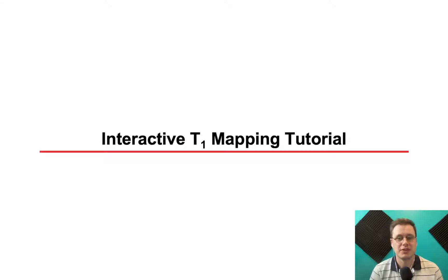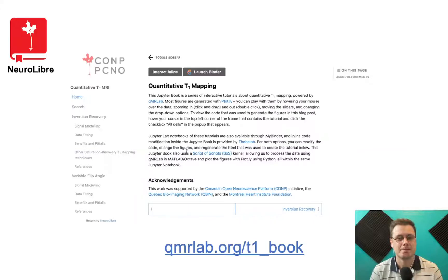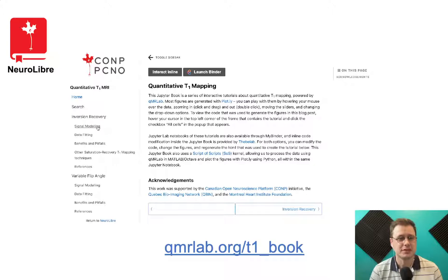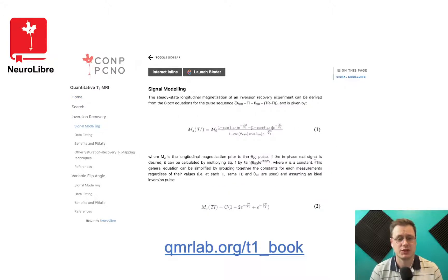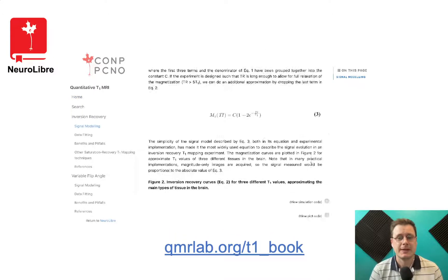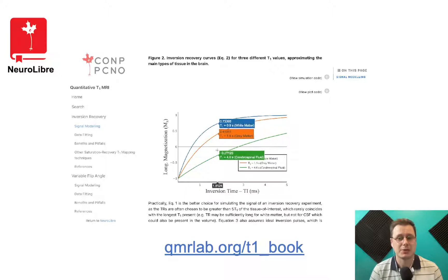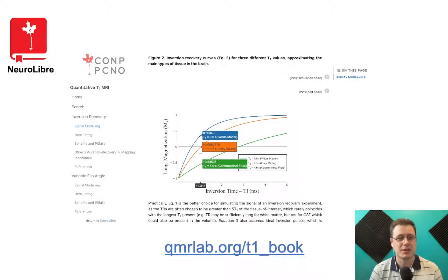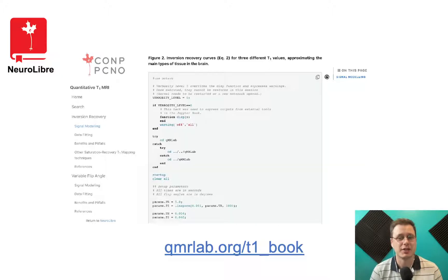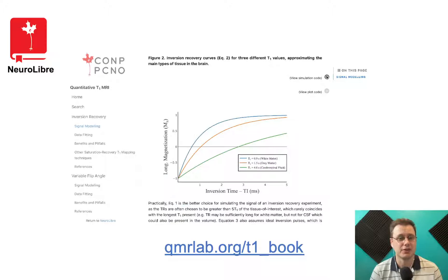Next, I'd like to briefly mention some interactive tutorials we've developed that focused on T1 mapping. Here's a short demo of one of these web tutorials. You can see there's a lot of explanations and equations. The figures are powered by Plotly, which makes them interactive. You can also view the code that was used to generate each figure above the figures.